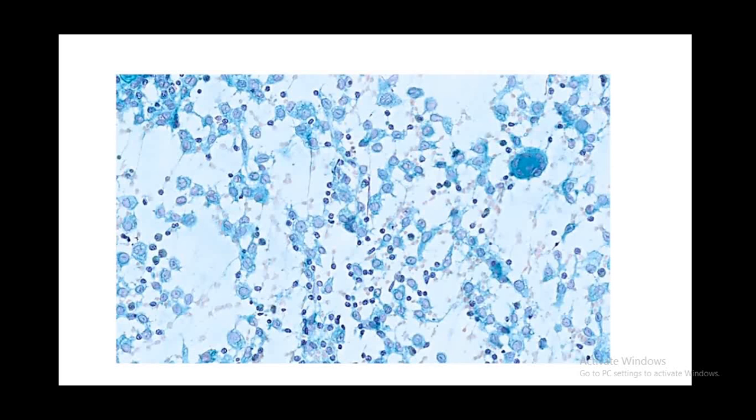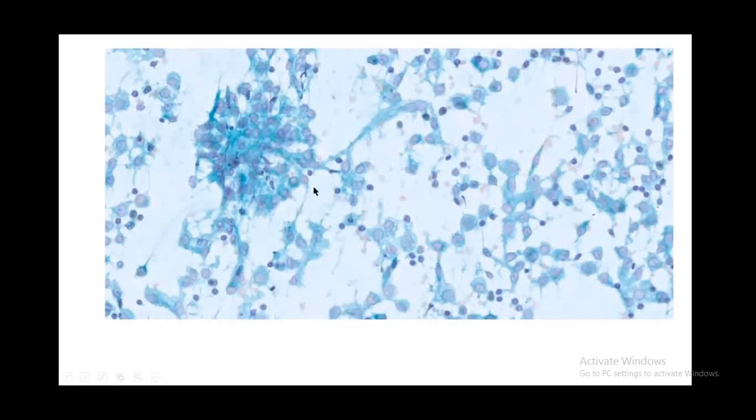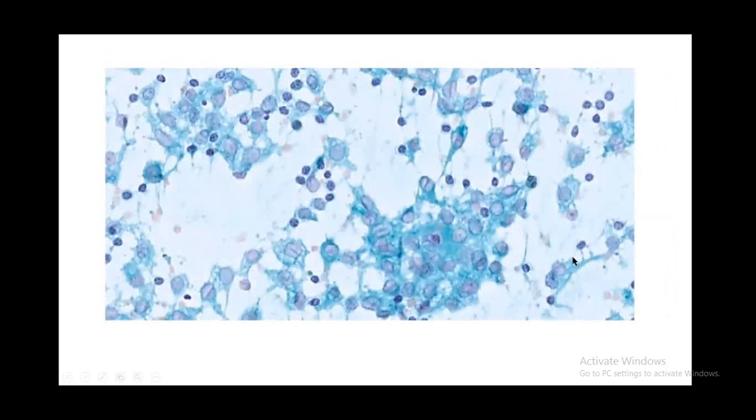These atypical cells did have a histiocytic appearance. Some aggregations were also seen, but typical granulomas were not identified. And these cells did appear very histiocytic on morphology, and they were admixed with lymphocytes. When we looked at the Pap stain, these cells appeared to show longitudinal grooves, some of them with very coffee bean appearance.